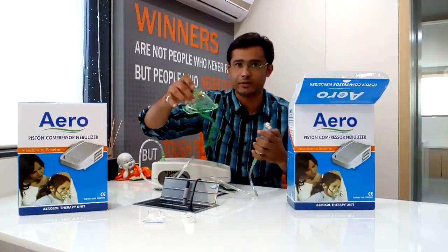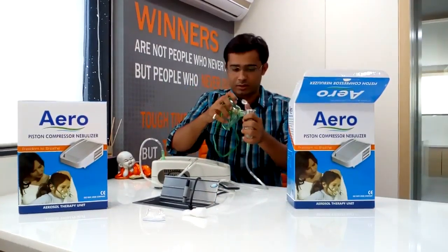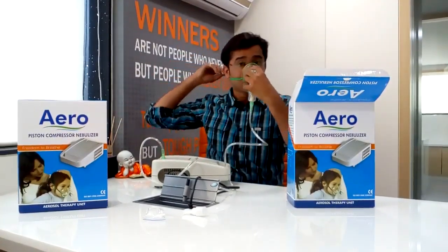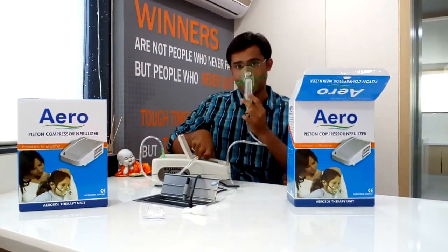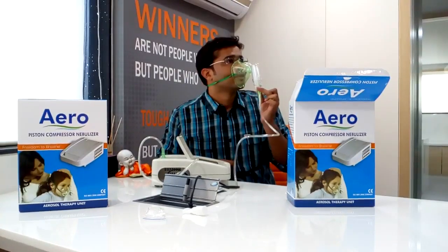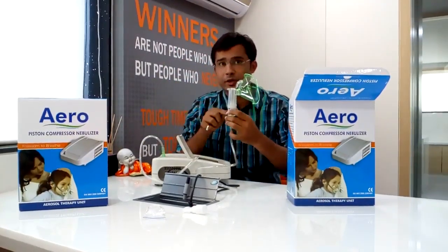Two options are given — you can use a mask or a mouthpiece. First I will show you how to connect a mask. It is connected like this. And now you have to press. It takes seven minutes to complete a dose.